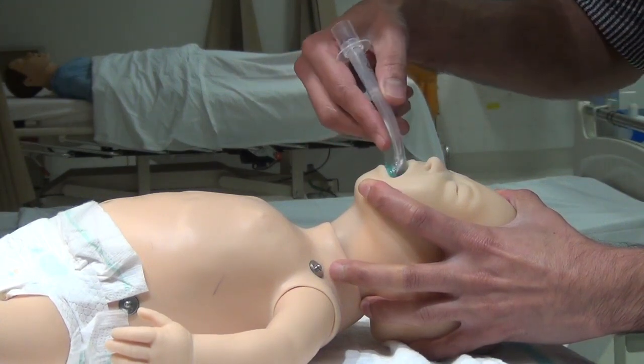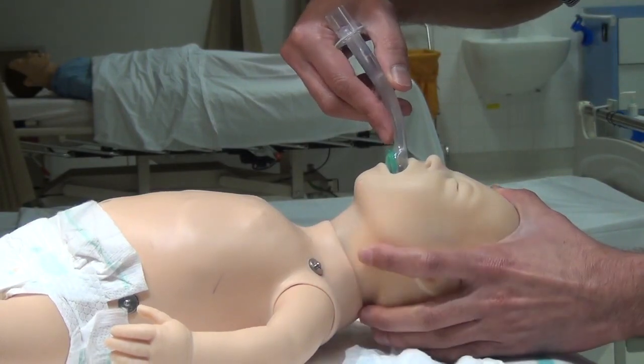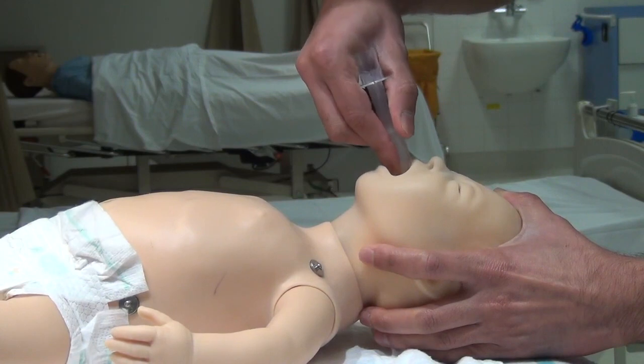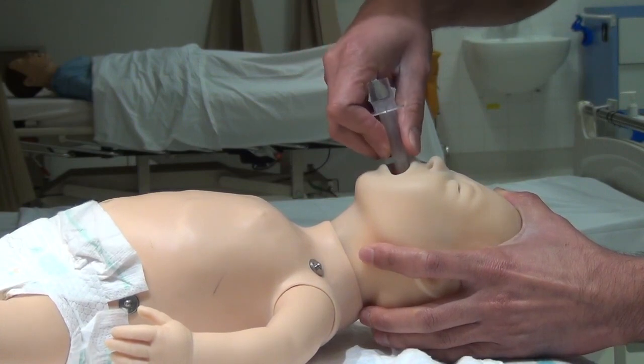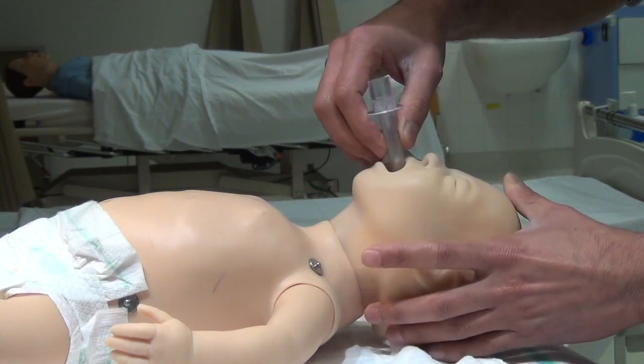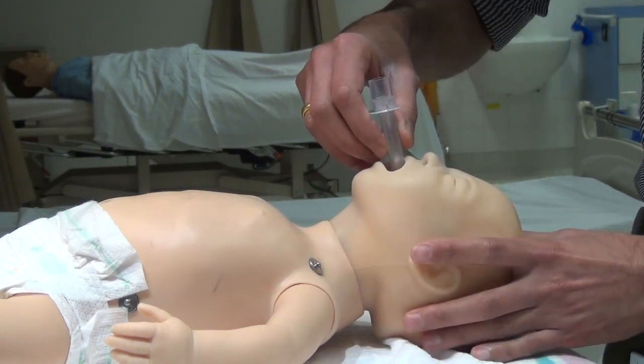Moisten the end of the iGel with oral secretions from the baby. Guide the end along the hard palate towards the back of the throat, past the tongue, with a continuous but gentle push until definite resistance is felt. Do not apply excessive force during insertion.